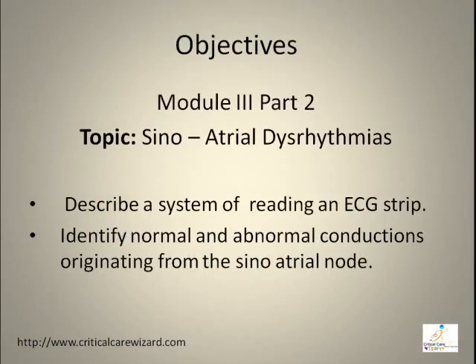Objective of this module. At the end of this presentation, the learner will be able to describe a system of reading an ECG strip and will be able to identify normal and abnormal conductions originating from the sinoatrial node.